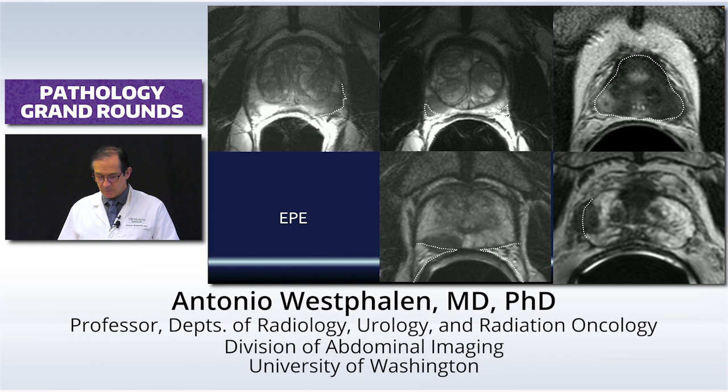Again, just to mention extraprostatic extension, when we see it, it's going to be a lot of extraprostatic extension to the pathologist because we do miss microscopic. We definitely cannot see capsular involvement that's microscopic.